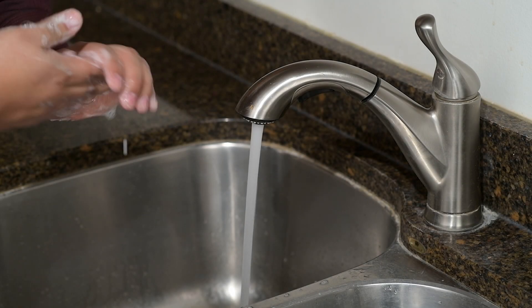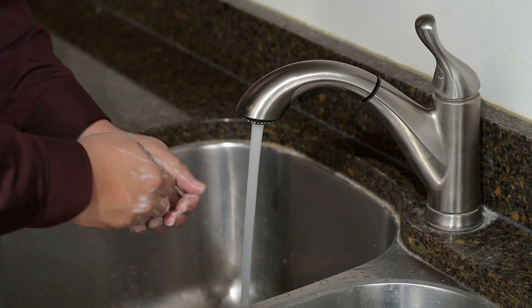To start, wash your hands with soap and warm water, then rinse and dry thoroughly.